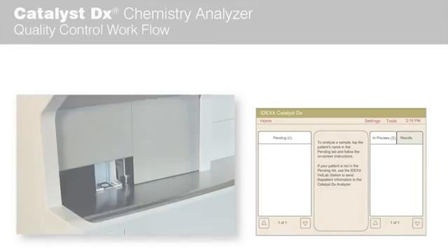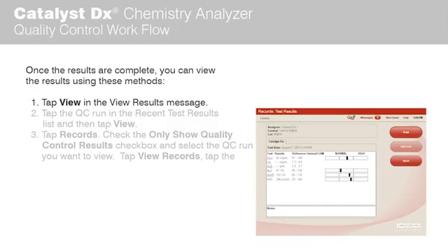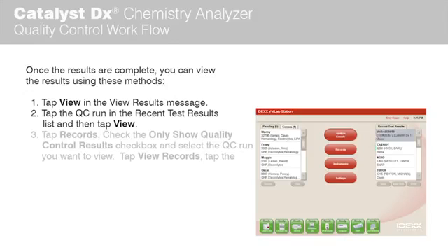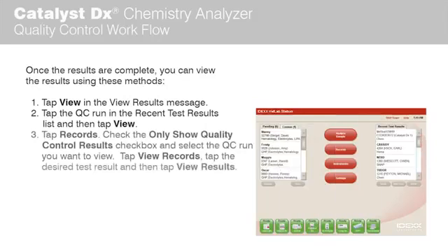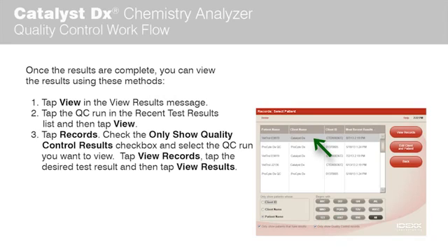Once the results are complete, you can view the results using the following methods. Tap View in the View Results message to access the Records Test Results screen. Alternatively, tap the QC Run in the Recent Test Results list on the IDEXX VetLab Station home screen, and then tap View. Or tap Records, ensure the Only Show Quality Control Results checkbox is selected, and select the QC Run you want to view.